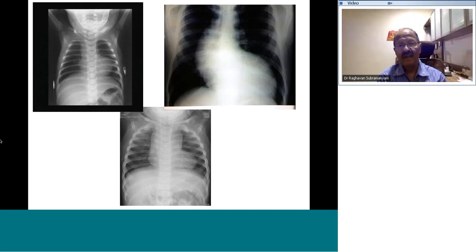Okay, possibly the last slide now. Yes. Quick answers and we are winding up after that. Let's start with the X-ray on the top left here. This one at 10 o'clock position. Start with that X-ray. That is simple.